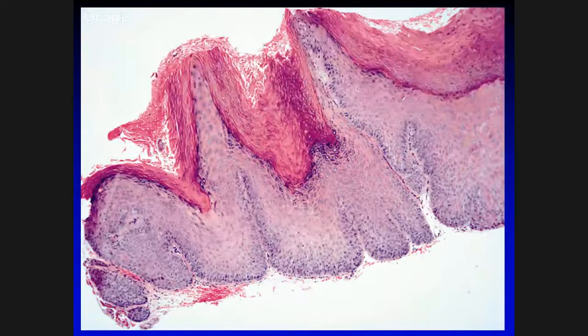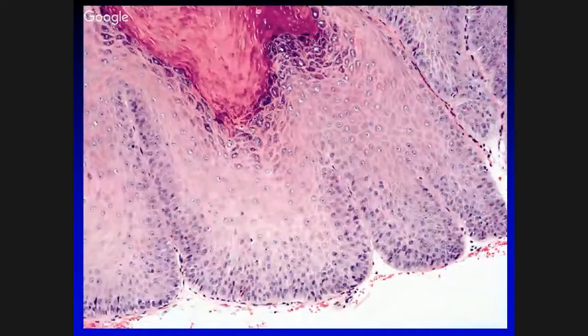And in other fragments, you can see what may be perceived as the features for verrucous carcinoma: the layered keratin, the verrucoid or papillary-like growth, the elongated rete, and absence of dysplasia. So let's say this is the patient's first presentation. He or she comes in with a 1 centimeter floor of mouth, lateral tongue, wherever you want, a verrucoid or leukoplakic lesion, and this is the biopsy. Is this enough to make the diagnosis of verrucous carcinoma? Anybody want to commit to that?